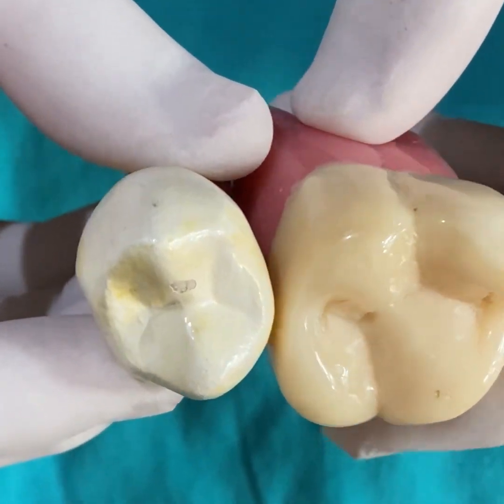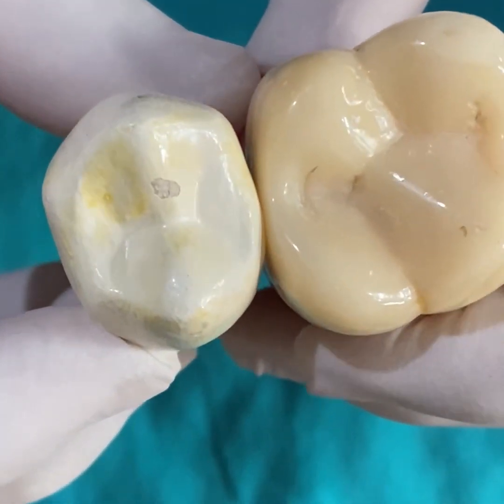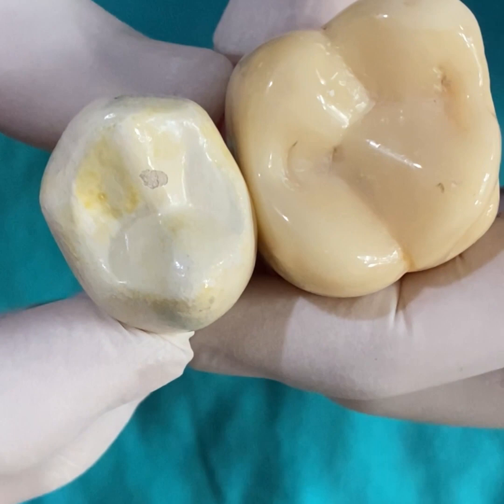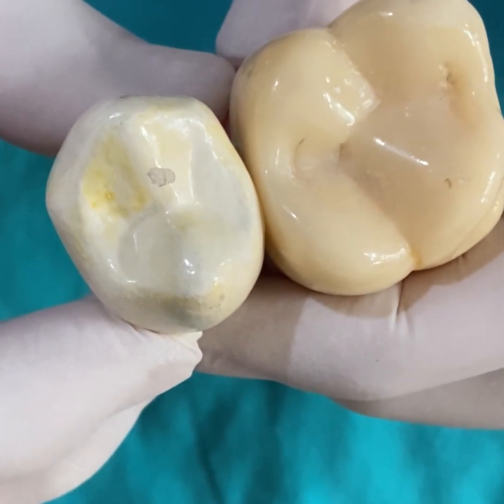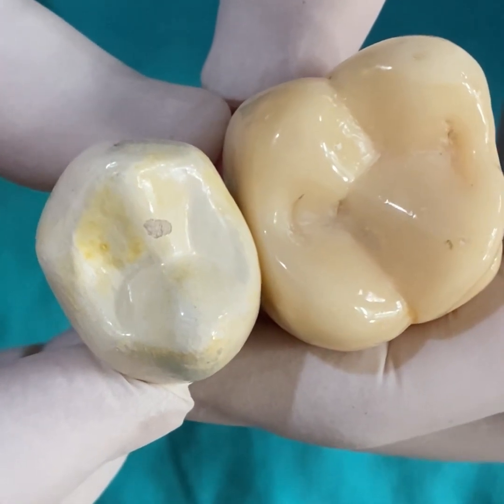And we are not brushing them. Look, this is how we have to clean these surfaces, and the gadgets to clean them are dental floss and interdental brush.